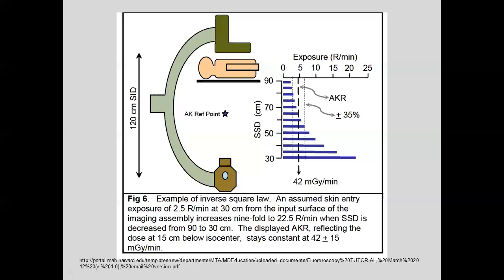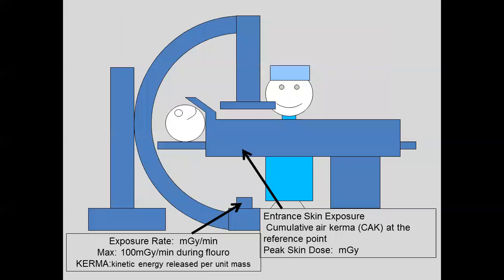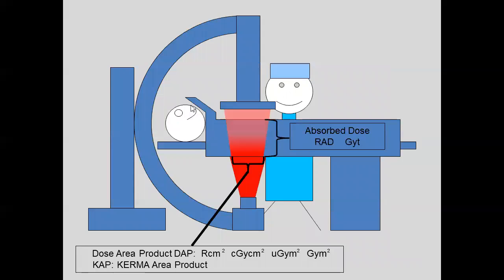The last thing I want to bring up is how the x-ray enters the patient. When the x-rays enter the patient, one of three things can happen. One, the x-ray can go straight through the patient, and that's what gives you your image. Another thing that happens, the x-ray can be completely absorbed, and that's what gives you your black and white: ones that get transmitted and ones that get completely blocked. The third thing that can happen is they can hit the body and scatter a little bit.